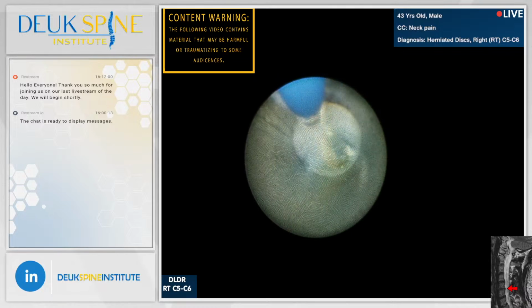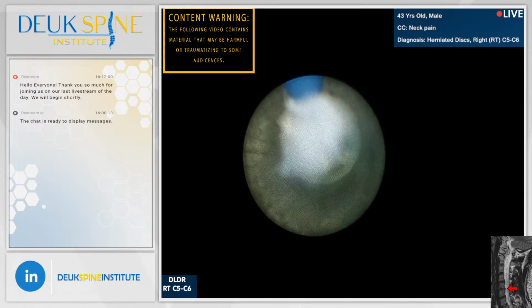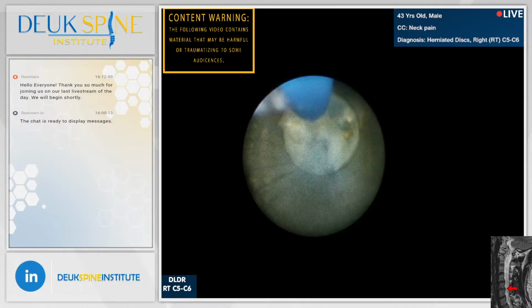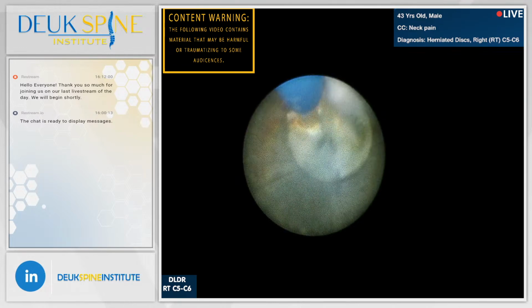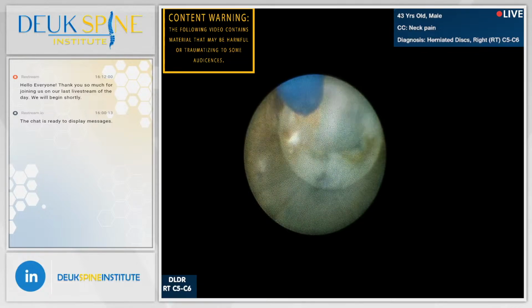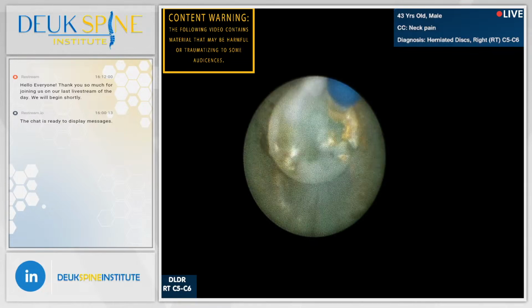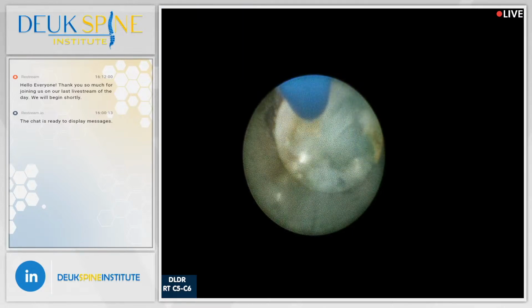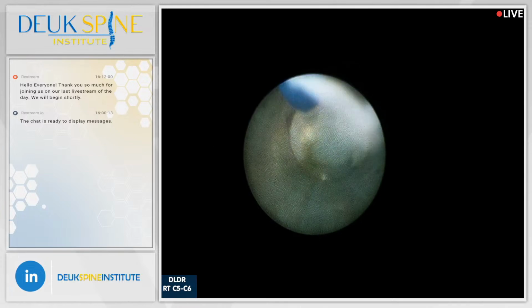Wavelength, yes, of the waves of electromagnetic energy that are used in the laser. This Holmium YAG laser, produced by an Israeli company called Lumenis that's now owned by Boston Scientific. We've been using the same laser now for 20 years. Actually, sorry, 17 years, because I've been doing this for 17 years. 17 years we're using the same laser. It's the best laser in the world.